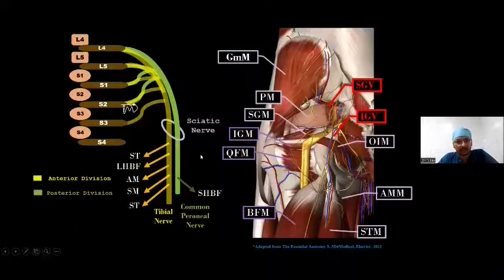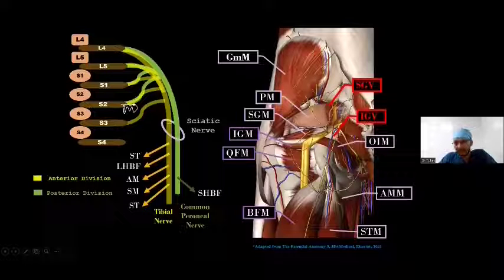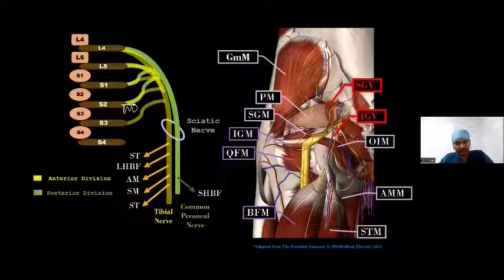The sacral plexus is formed within the pelvic cavity, and after formation, it comes out of the greater sciatic foramen and lies on the anterior part of the piriformis muscle, covered anteriorly by the pelvic fascia. The pelvic fascia separates it from the hypogastric vessels and the pelvic viscera. After formation, it runs below the piriformis muscle. Sometimes the common peroneal branch can also pierce the piriformis muscle instead of running below it.